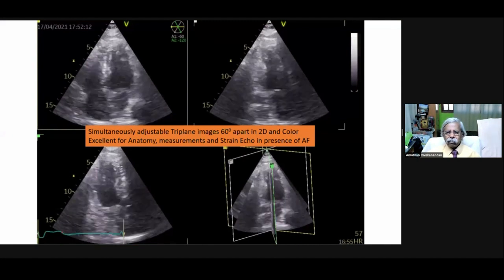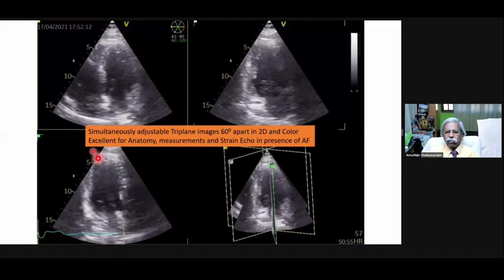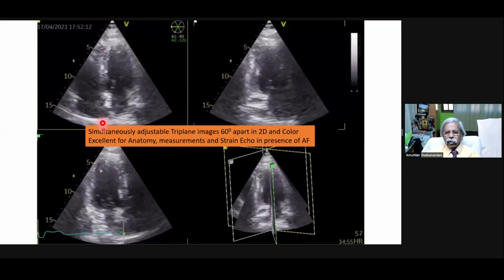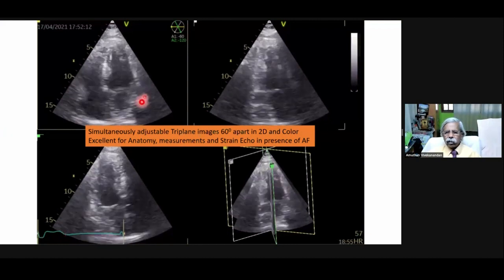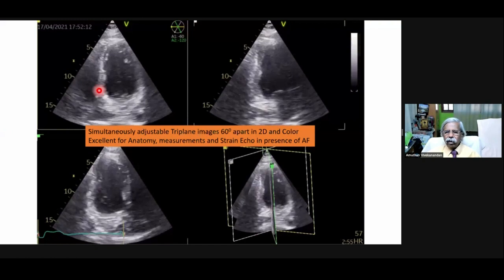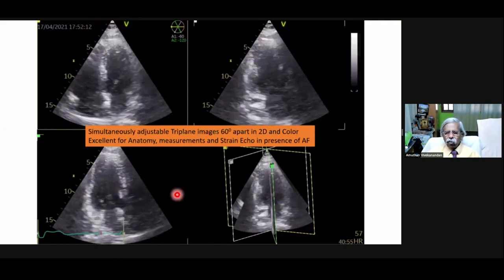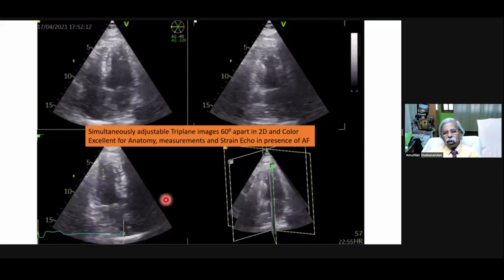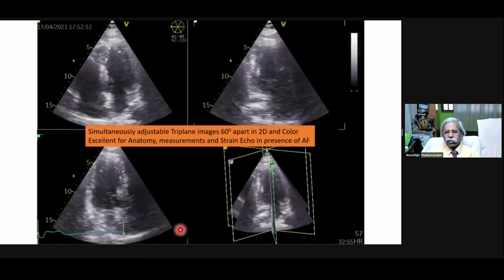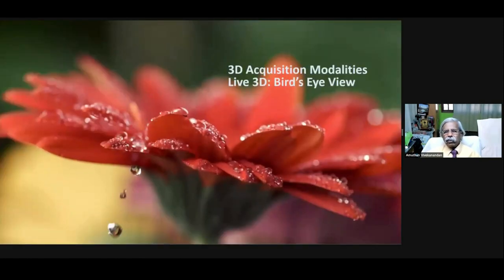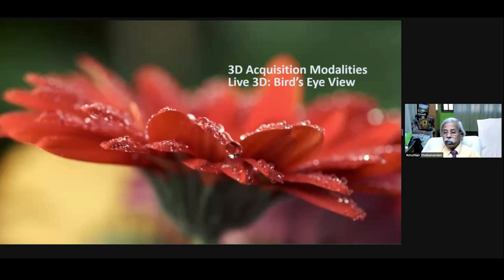Triplane view gives you long axis, apical four chamber, apical three chamber, 60 degrees apart, and you can see all regional walls in this view. Before switching on to full volume, check whether you are able to see all the walls. It is especially useful in patients who are having atrial fibrillation to select a particular beat.